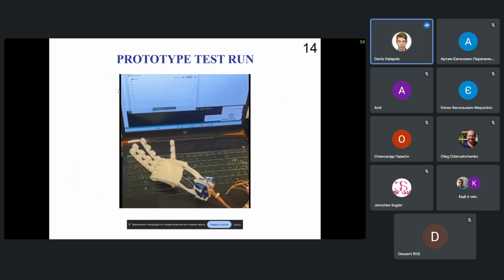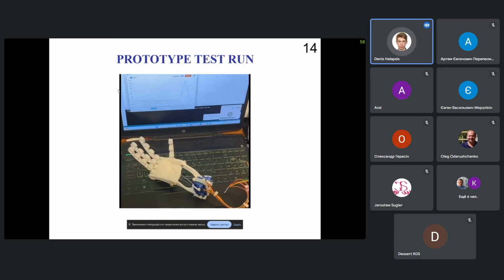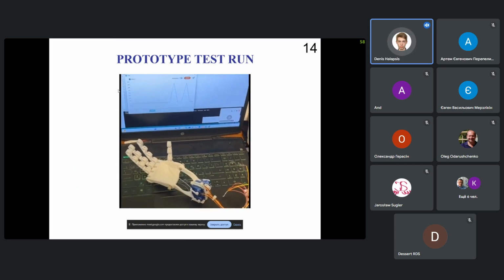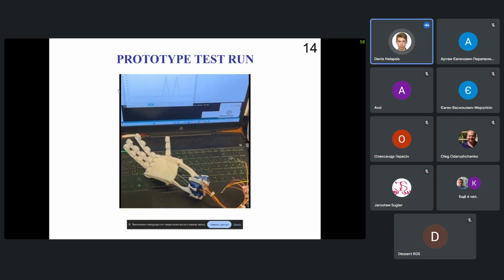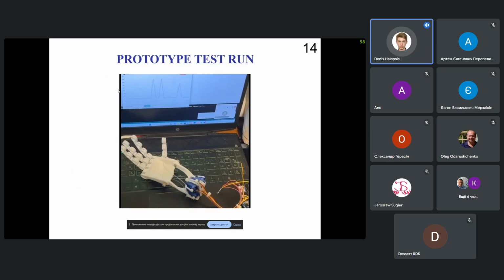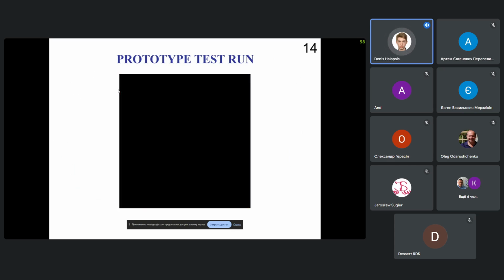So once we have connected it to the hand, you can see on the graph voltage peaks caused by muscle activity, and they relay to the motion of the fingers. As you can see on the background, the voltage peaks are linear. They appear linear, although, of course, they are not fully linear by nature. However, for the purposes of this simulation, such an algorithm has proven enough.